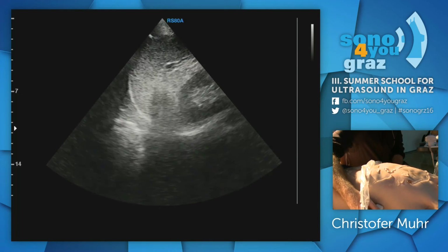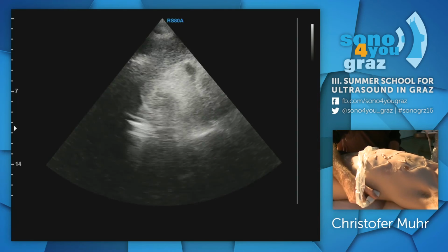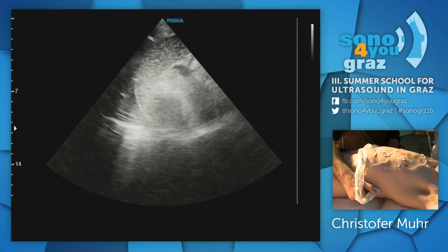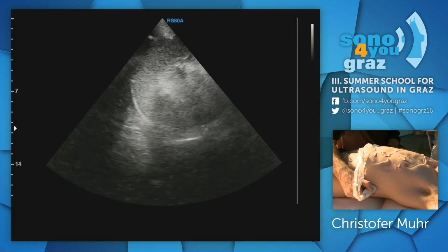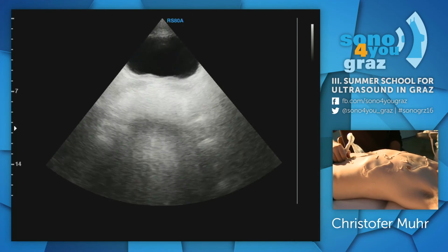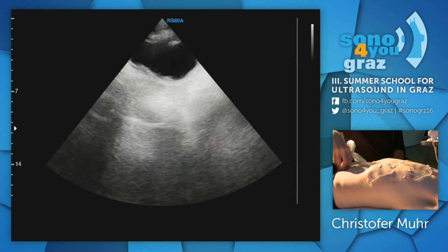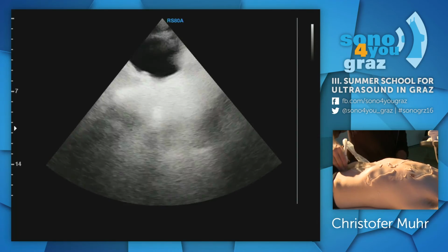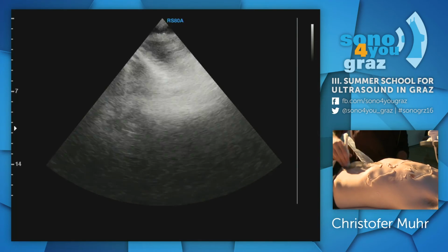And then this is where you tell me you had a splenectomy, right? So I don't see any free fluid around the spleen. It looks like you have a huge amount of pleural effusion on the left side, but I don't care about that. And it looks nice here. Are you okay? Okay, small bladder, big prostate. Don't laugh. Okay. I don't see any free fluid in your pelvis.